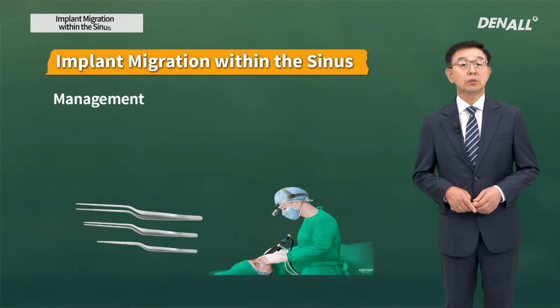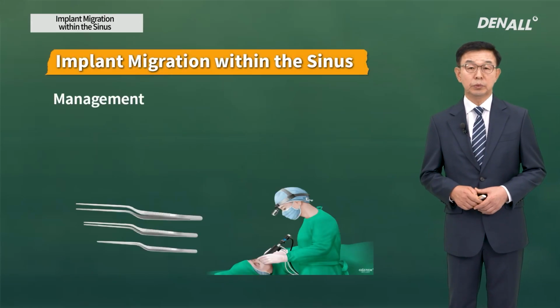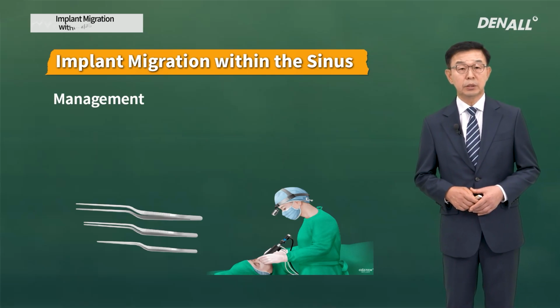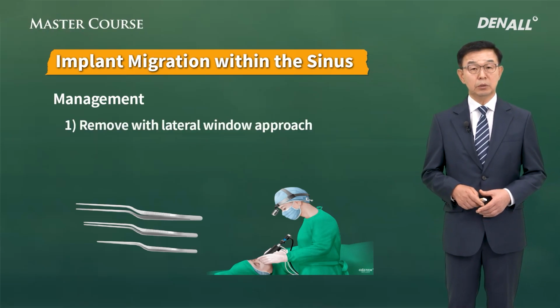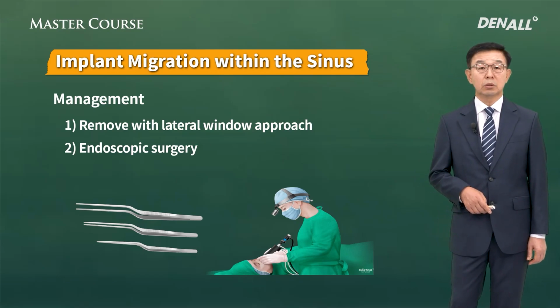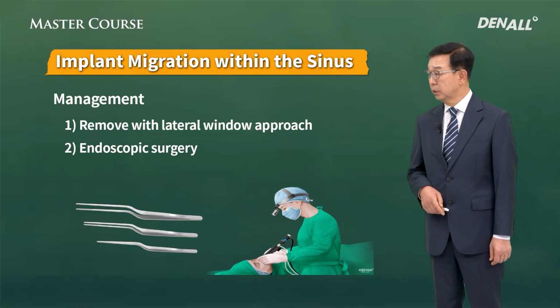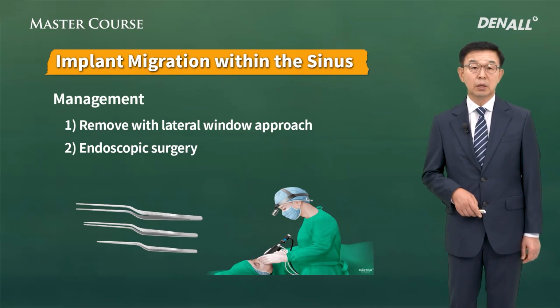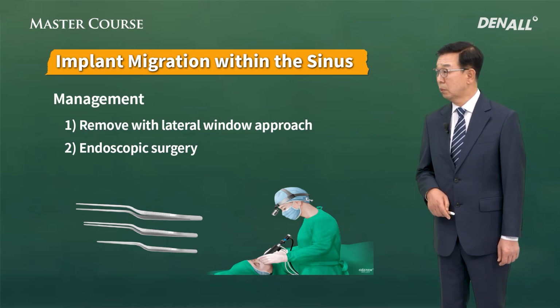If an implant migrates into the sinus, how should we address it? First of all, you need to remove it as soon as possible. To do so, you can use the lateral window approach, or rarely endoscopic surgery may be necessary. The easiest and simplest way is to use the lateral window approach to remove the implant.